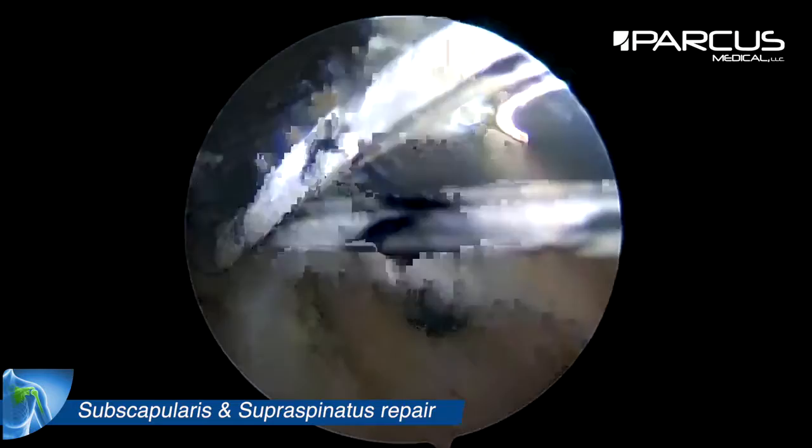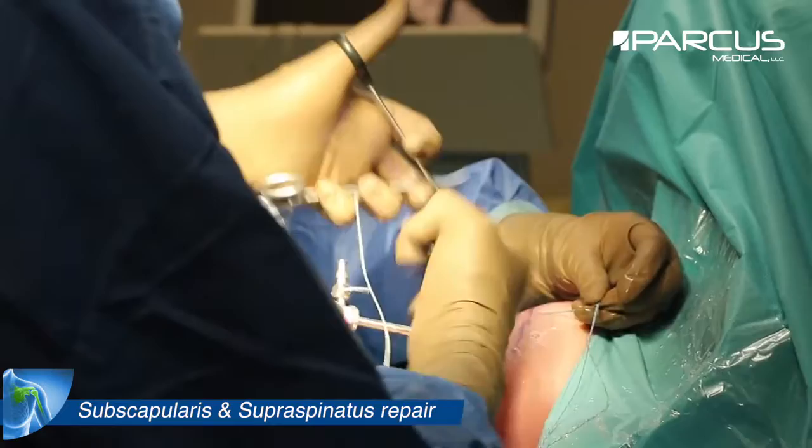We then tie the knot on the posterior part of the tear, which closes the L.